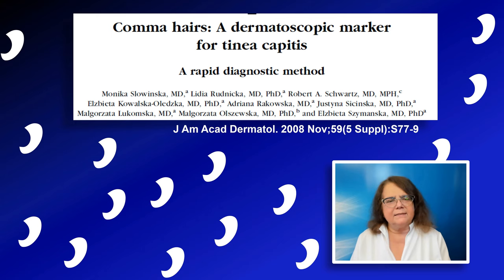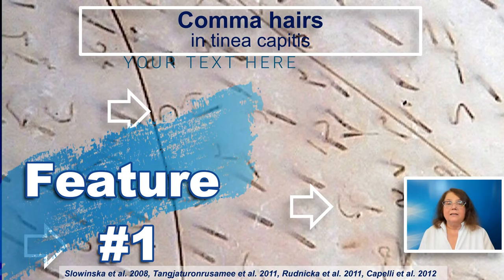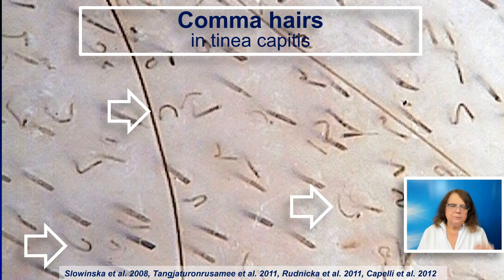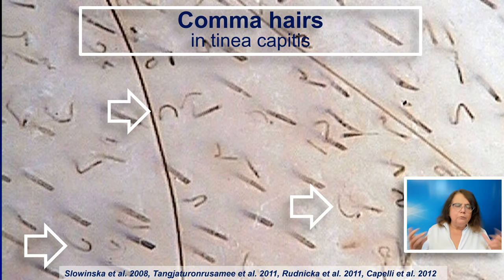There are now more typical features described, but still the comma hairs remain the most typical feature of tinea capitis. Here is a trichoscopy image with the arrows pointing to the comma hairs or c-shaped hairs, which are the typical feature of tinea capitis. If we see just one c-shaped or comma hair-shaped structure, this is not sufficient to make the diagnosis. But if, as in this image, we have a field of view full of comma hairs, we can be almost certain that this is tinea capitis.